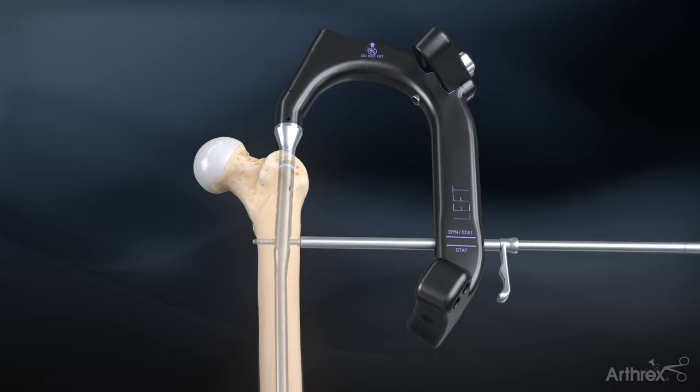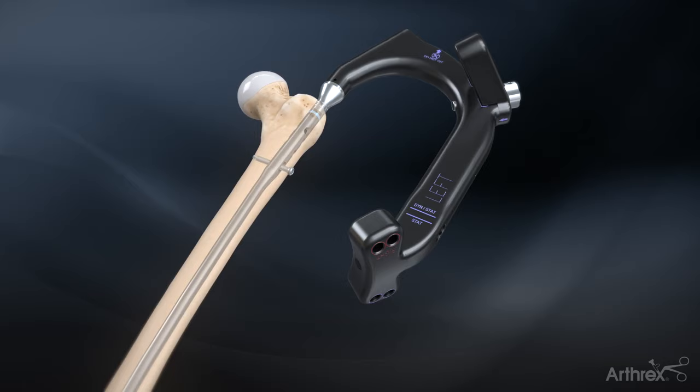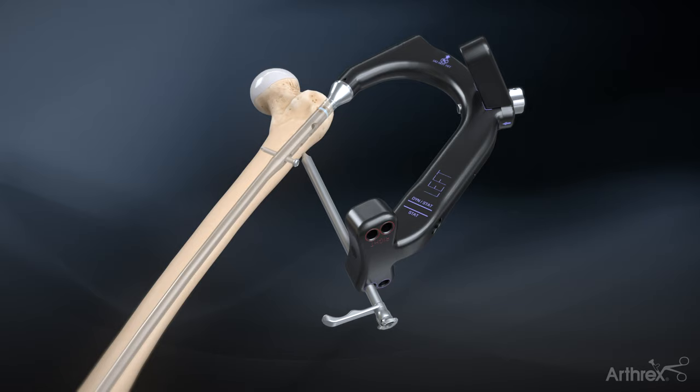The sheath is removed and the reassembled screw sheath pin guide and obturator assembly is slid through the distal hole on the targeting guide. Remove the obturator and insert the 3.2 mm guide pin through the guide and into the femoral head.